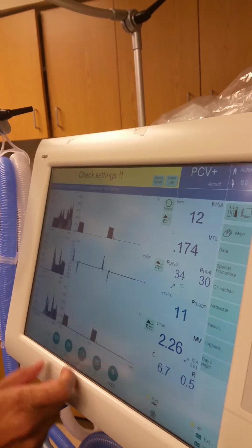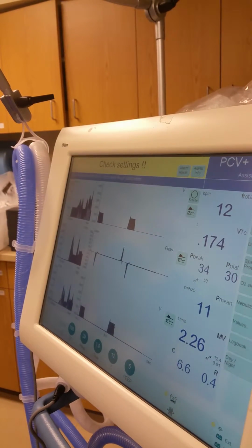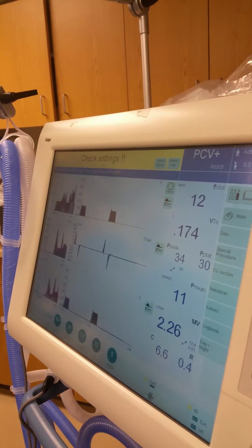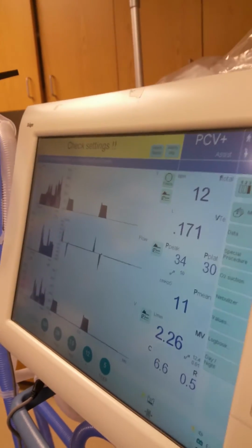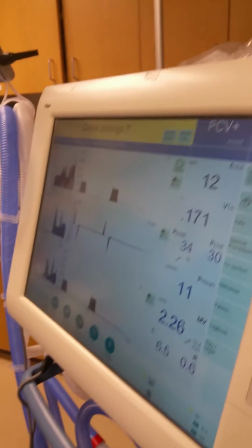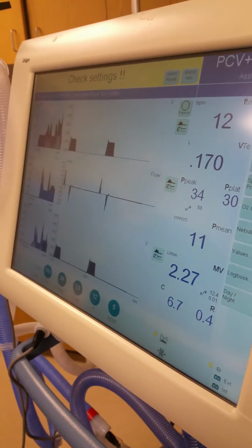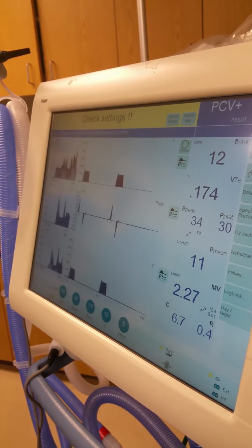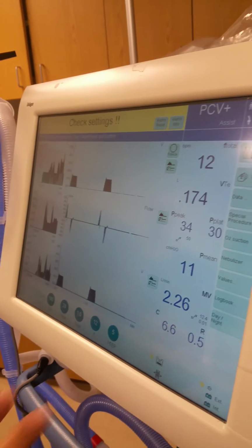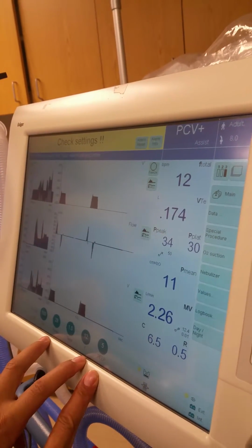But usually if you get an adequate tidal volume, you increase rate, because I want to do less damage to your lungs. So the way I can do that and protect your lungs is stay with a smaller volume and increase my rate for you to blow off your CO2. Does that make sense? So you want to try to do less damage to your patient. So increase frequency to blow off ventilation. So these three do oxygen. These two are going to help with ventilation.